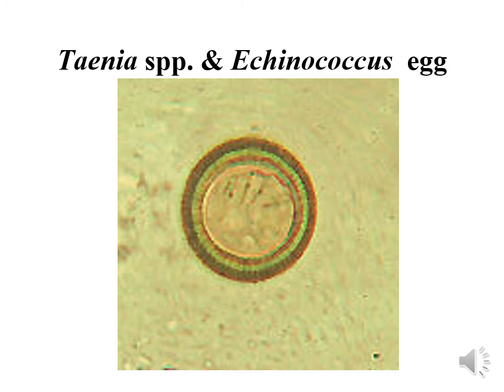It is difficult to distinguish the Taenia eggs. So we have what is known as Taenia species eggs. This typical egg could be an egg of Taenia saginata, of Taenia solium, or Echinococcus species. And we have a couple of Echinococcus species causing hydatid disease, and their eggs look like Taenia eggs. So we call it Taenia species and Echinococcus egg. All are characterized by being circular or rounded with thick striated eggshell, and internally we'll find the hexacanth embryo, the embryo with 6 spines or hooks.